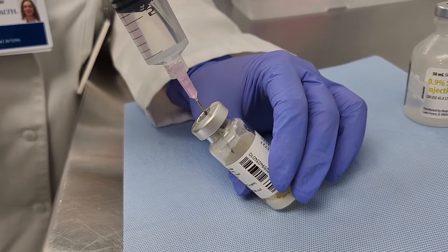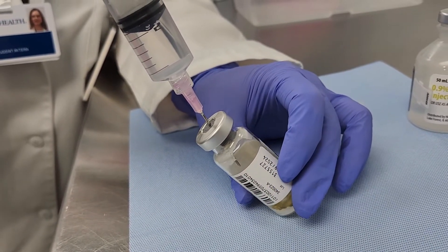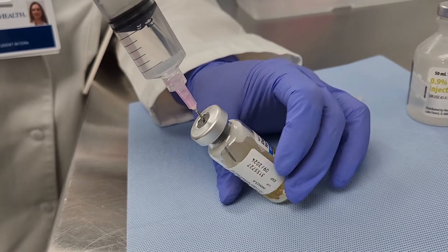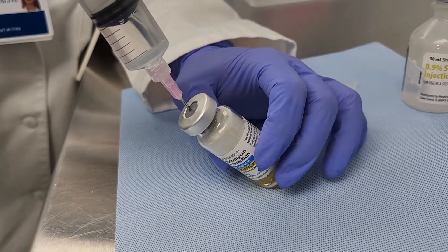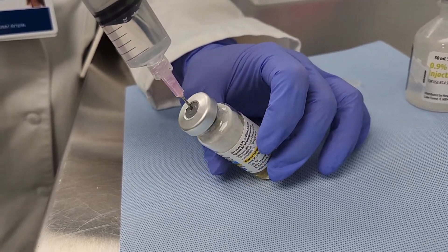Slowly inject the 10 mL of saline into the daptomycin vial. Aim the needle towards the wall of the vial to minimize foaming. Carefully spin the vial while injecting to ensure all powder touching the vial walls is wetted.